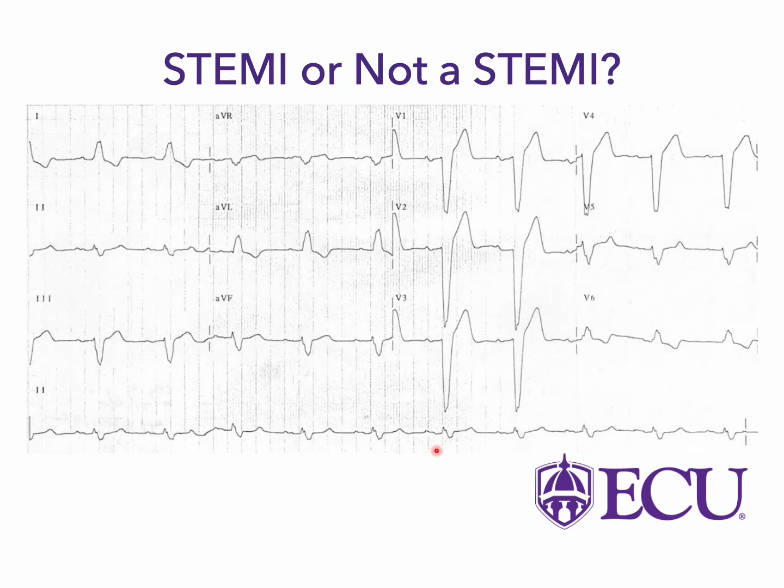So just eyeballing it, right? What jumps out to me immediately is these huge complexes in the anterior leads. And I can convince myself, rightfully so, that there's ST elevation here, right? This ST segment is certainly elevated both above the TP segment, right, and my PR segment here. I see that in V1, V2, V3, and V4, and I'm concerned, right?